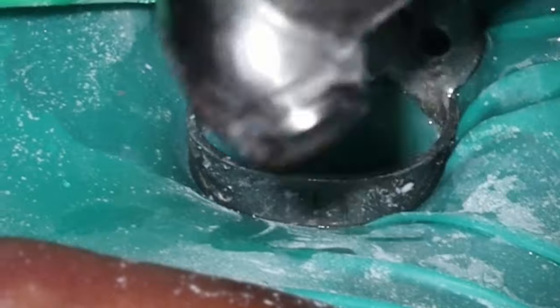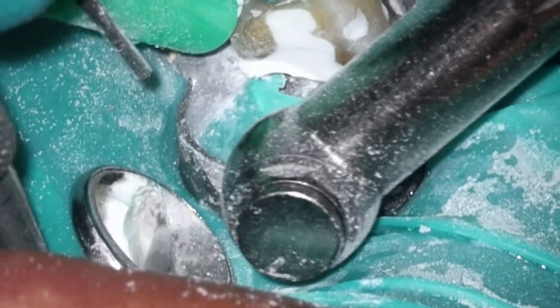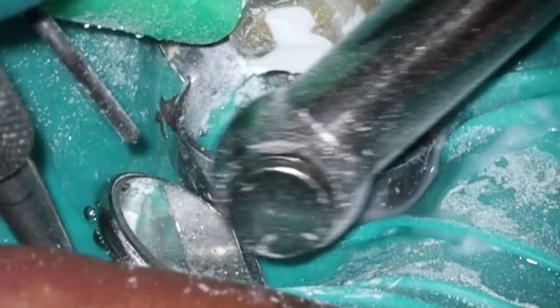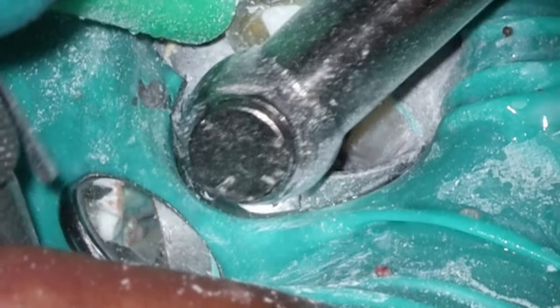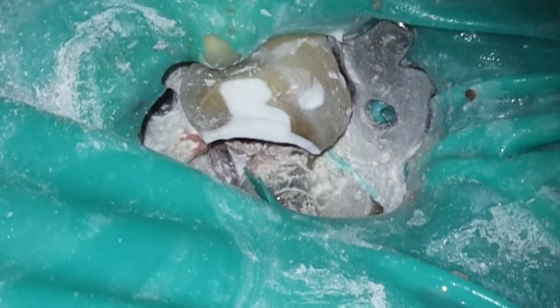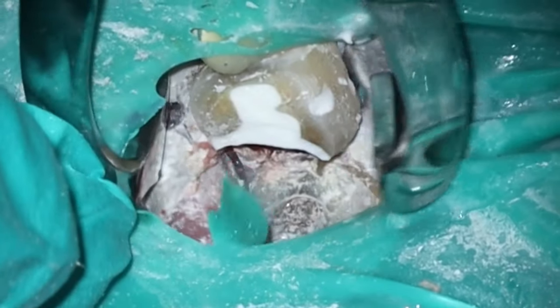To make the general dentist's life a little bit easier, I put in a tiny margin — nothing super extensive, but enough that they'll be able to tell where it is, because it is pretty far down — probably 10 to 12 millimeters down. That's a long way to prep without the help of a microscope. You can see I'm hitting the rubber dam. Looking at the mirror, I'm getting some pretty clear connection between the tooth and the composite itself. Unfortunately that rubber dam piece is getting in my way, so I'm going to go ahead and pop this off — finish up. The patient was super compliant, very easy, tongue cooperative.